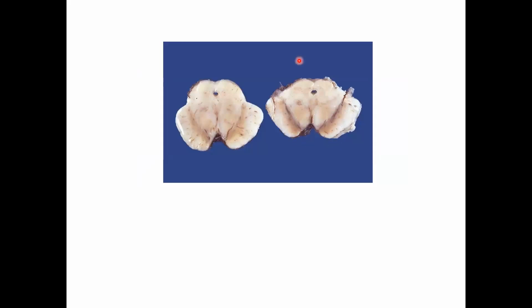This is another picture of a person with Parkinson's disease. Parkinson's disease إيش بصير في عندهم؟ بصير في loss of the pigmented neurons in the substantia nigra. This is the normal. شايفين pigment is maintained. هذا اللون البني. The person with Parkinson's disease شايفين صار في loss of pigment in this area due to death of these pigmented neurons.